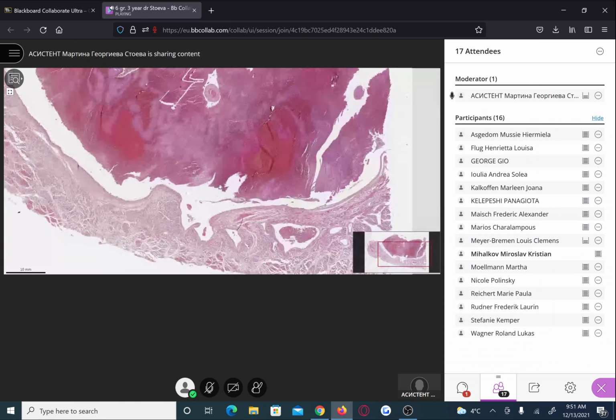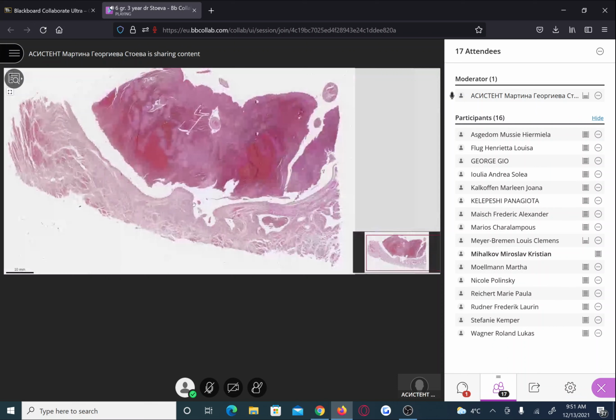You know that after you describe the slide, you can be asked anything like Virchow's triad or what is the mechanism of developing of the thrombi, what could be the cause. We already discussed the causes during the classes, like myocardial infarction, for example, could be a cause. There is some evidence of myocardial infarction here.